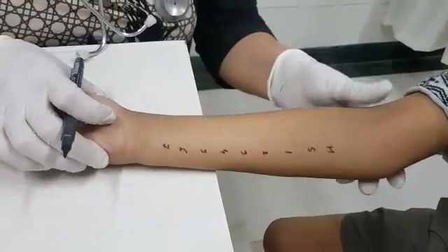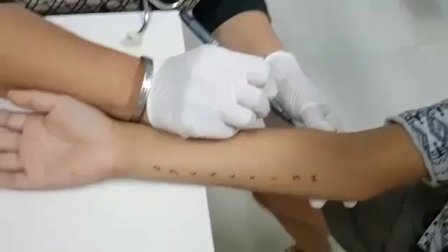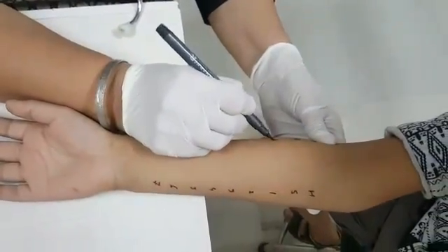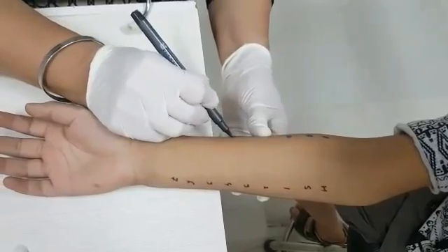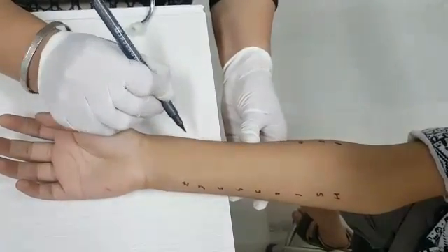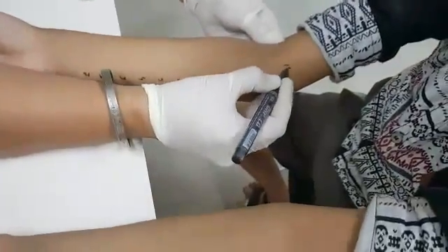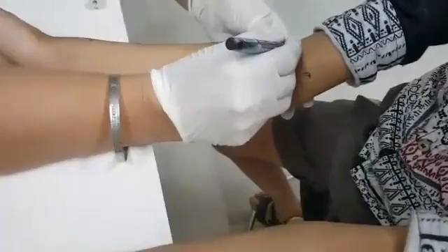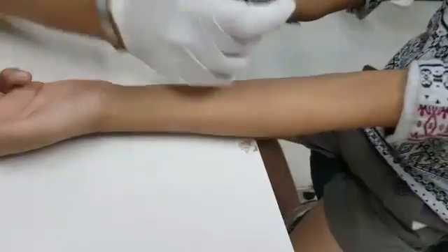It is a very simple and very specific OPD procedure and there is nothing to worry about. It is not like the child is going to get a lot of pricks. This is the specificity of the procedure: whichever allergen comes positive, it comes positive, and whichever comes negative, it comes negative. On this arm we put the aero allergens, and this arm we are going to mark for the food allergens.